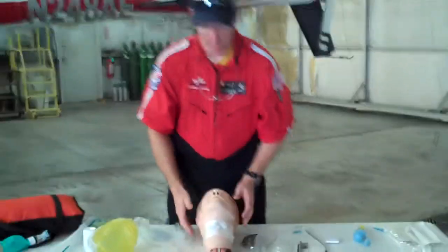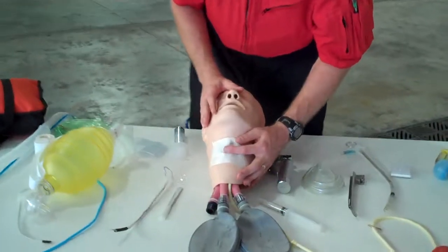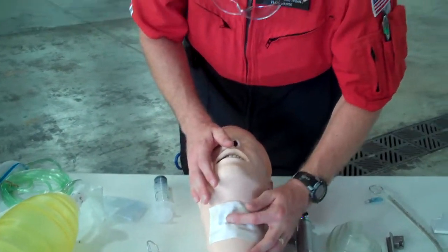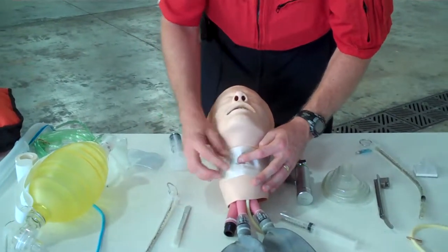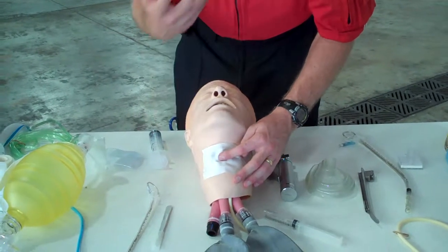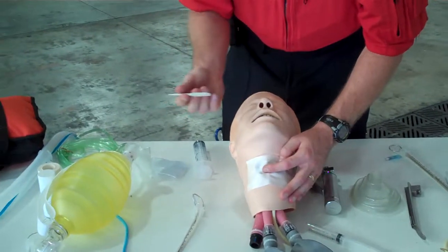So let me demonstrate on the mannequin here. Let's just say I found my landmark. Once the landmark is found with my finger, I'm going to keep my finger on it. So I've found the landmark. This is a mannequin that we practice crics on, and I put a piece of tape over it to make it feel like skin. I'm going to take a scalpel. You get into the position of comfort.